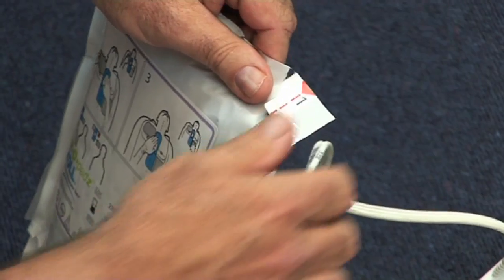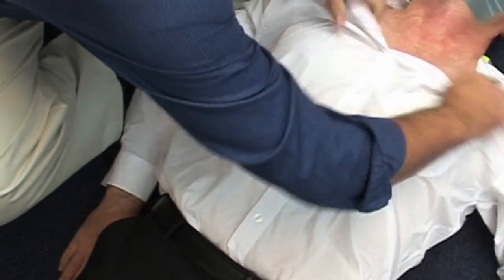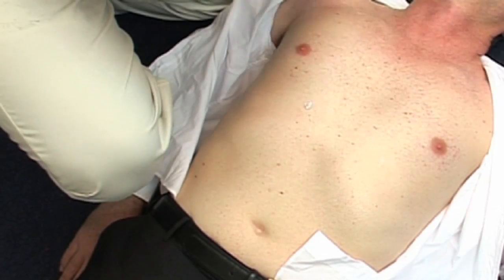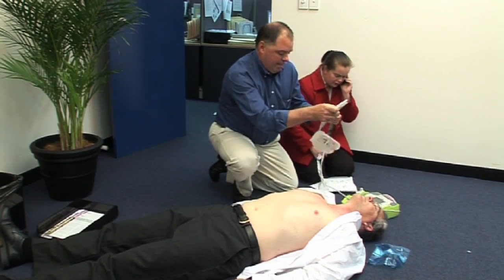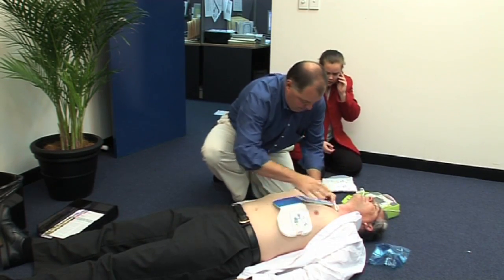You will now need to attach the electrode pads onto the person. Open the sealed package. Note that the electrode pads are already connected to the unit. You may need to use the scissors to remove the clothing, and the paper towel is to dry the chest in case of excessive moisture or sweat.